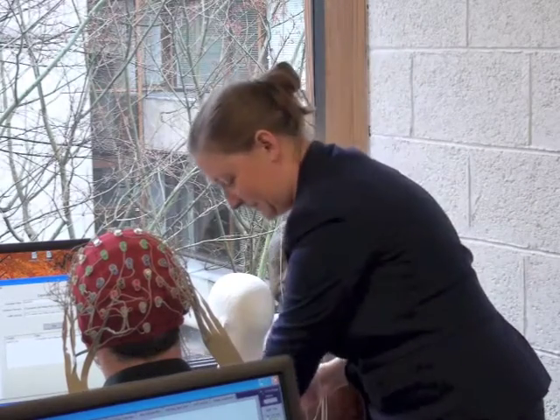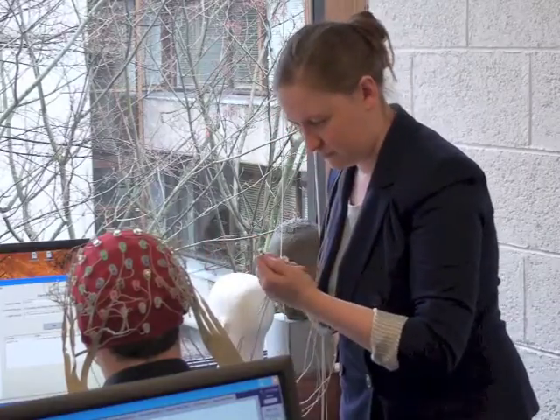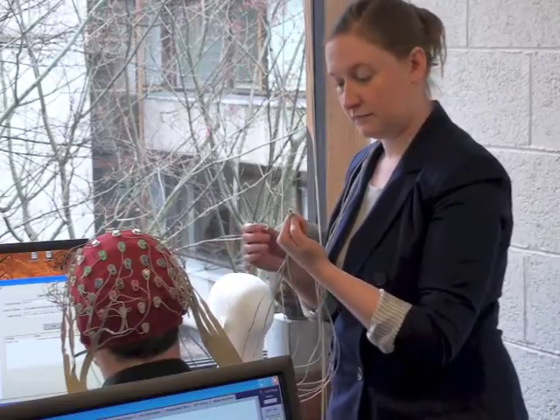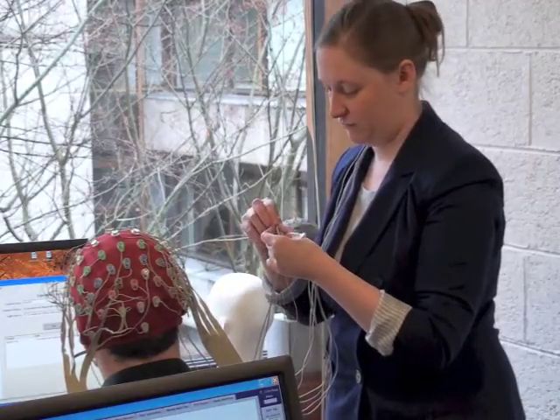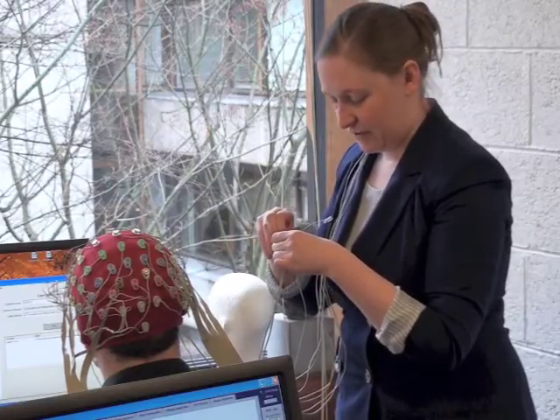And is there a reason, Helen, why you do these after the cap? Just because they're more likely to fall off with time. They're not secured, so if they were on beforehand, I think they'd fall off quicker. I only have 6 here at the moment.